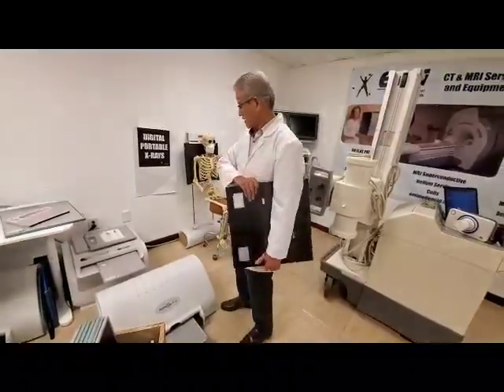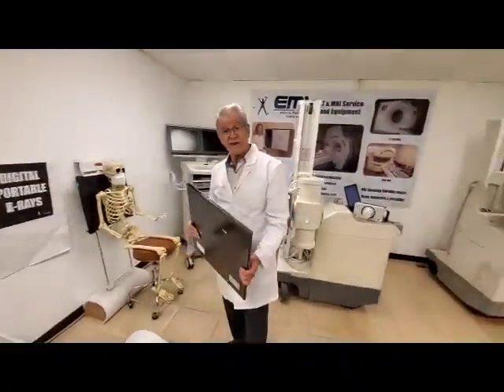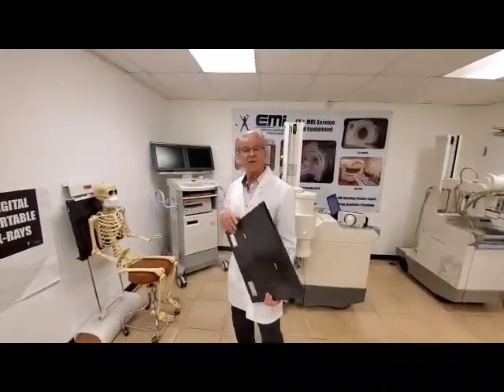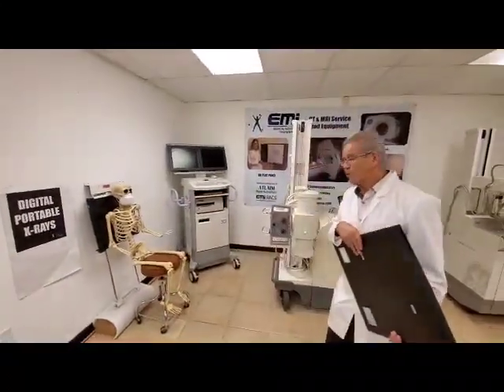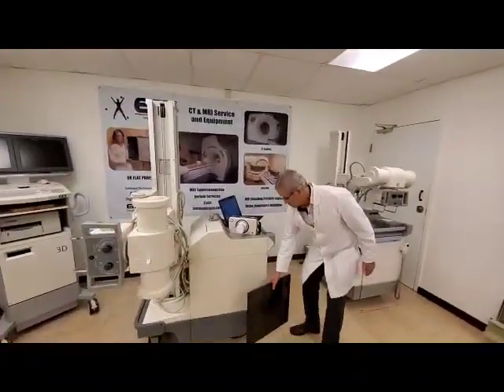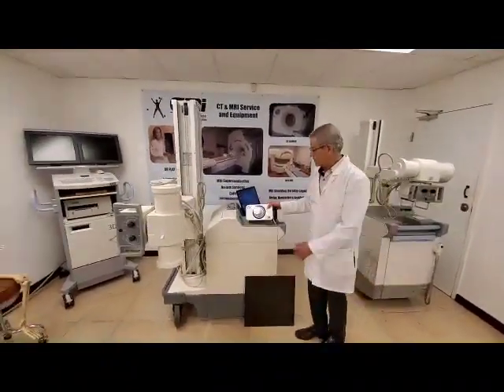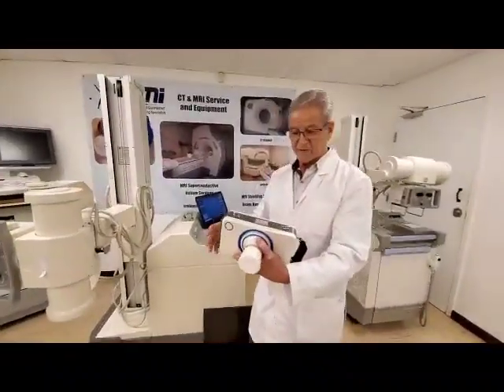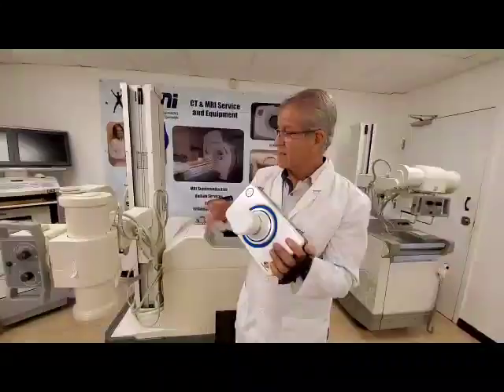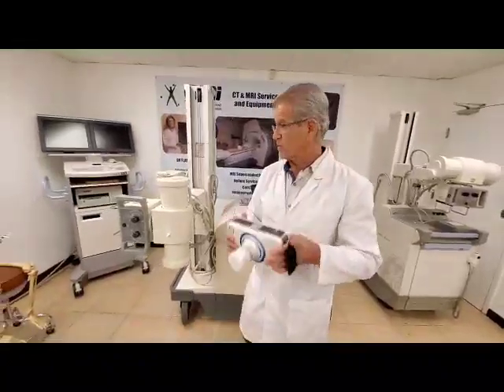This system has no moving parts and we are going to see how fast it is — it takes about three seconds to take a picture — and the quality of the image is immediately very good. We are going to do a test with this portable x-ray machine, which is battery operated and very light, and of course we can also use any bigger, more powerful machine.